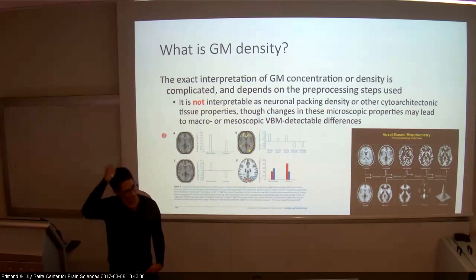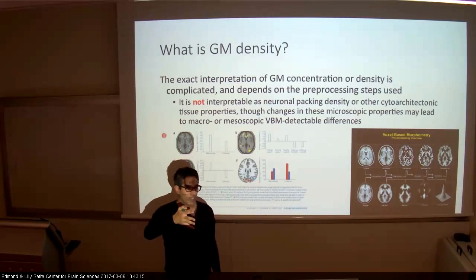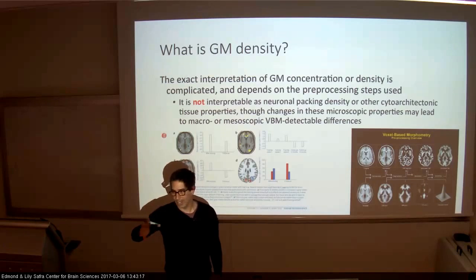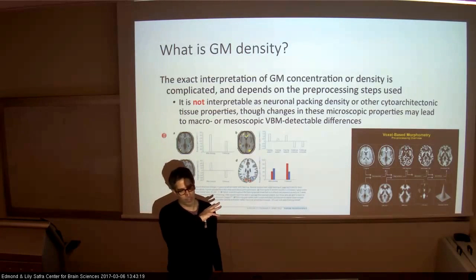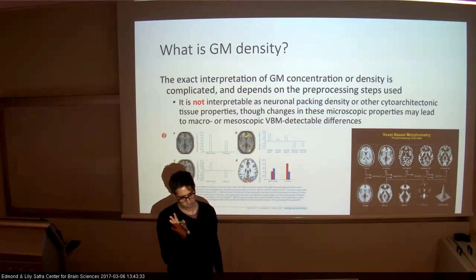Was it first T1 weighted or T2 weighted? So it's also affected by the fact that I use a T1 weighted image for sure. Maybe if I would use a different image and do my segmentation, and I would show an article that criticizes that, it will change. Yes, given the image that we use and given the assumption that my T1 weighted and your T1 weighted were the same. If there was a little bit of difference in the way my image came out in terms of weighting of T1, that could be the main source of the difference.